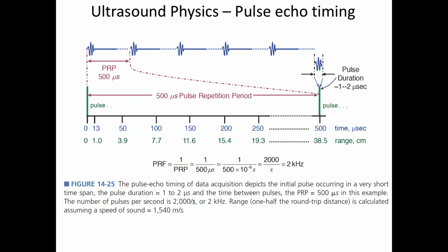If it's a liver, say it's 1500 meters per second, right? So you pretty well know how deep you're going to see stuff. And if you want to see stuff deeper, you can crank this amplitude and increase this time, right? So if we want to go deeper.